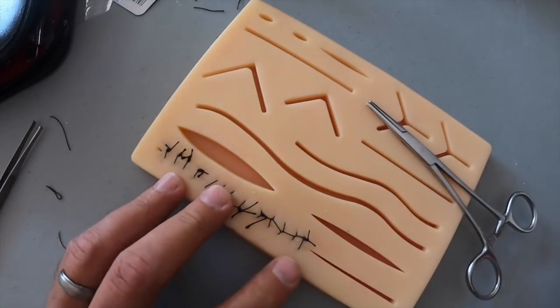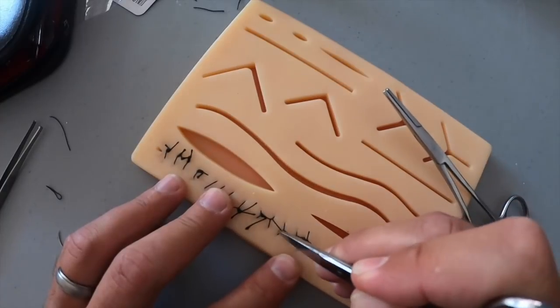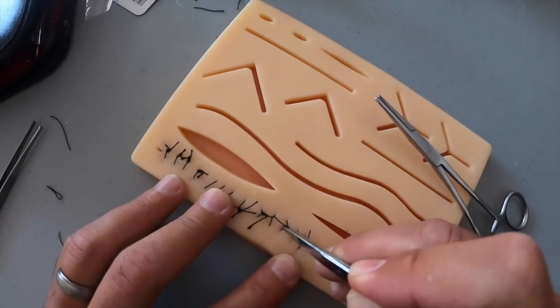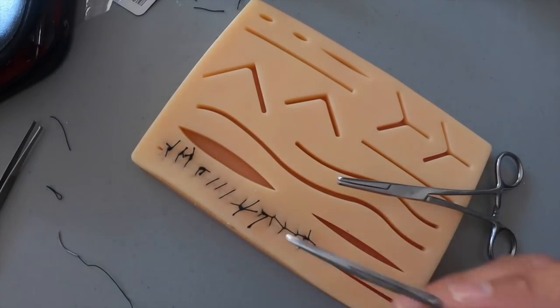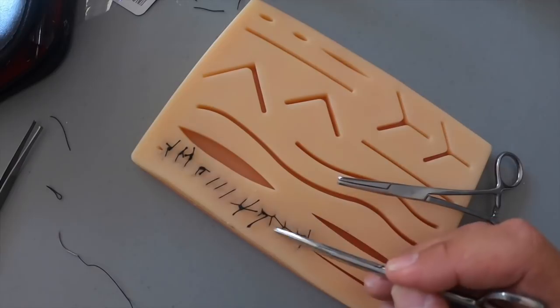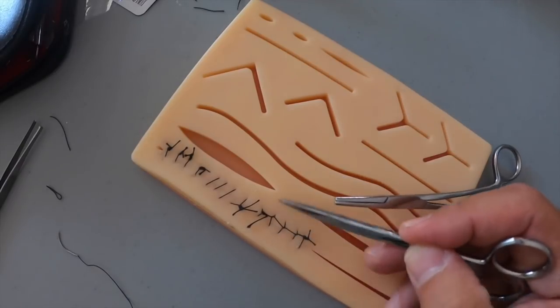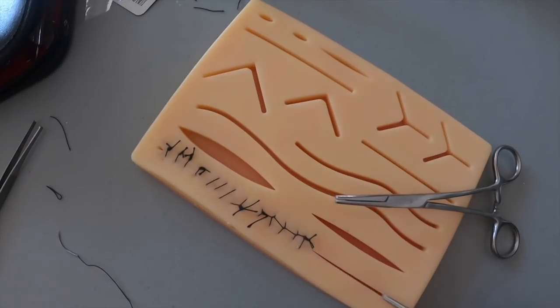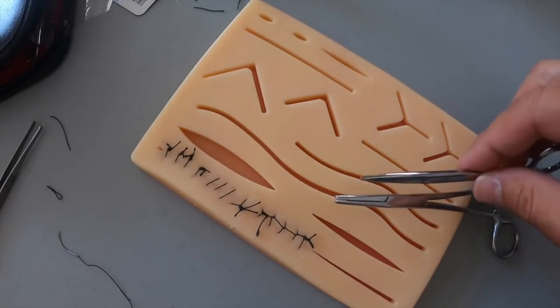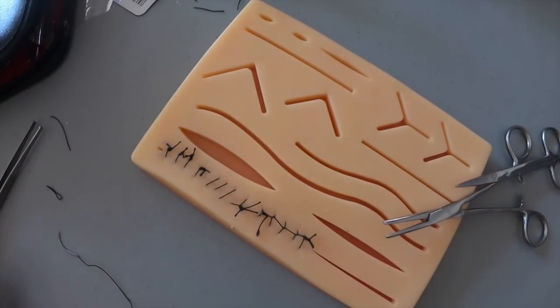And this is a continuous interlocking. Again, this is not what it would look like in real tissue, I'm going to show you what it looks like in real tissue. But basically you're coming through each one, through each one and interlocking with the loop so that it holds its stitch together as you continue to move through the laceration repair.